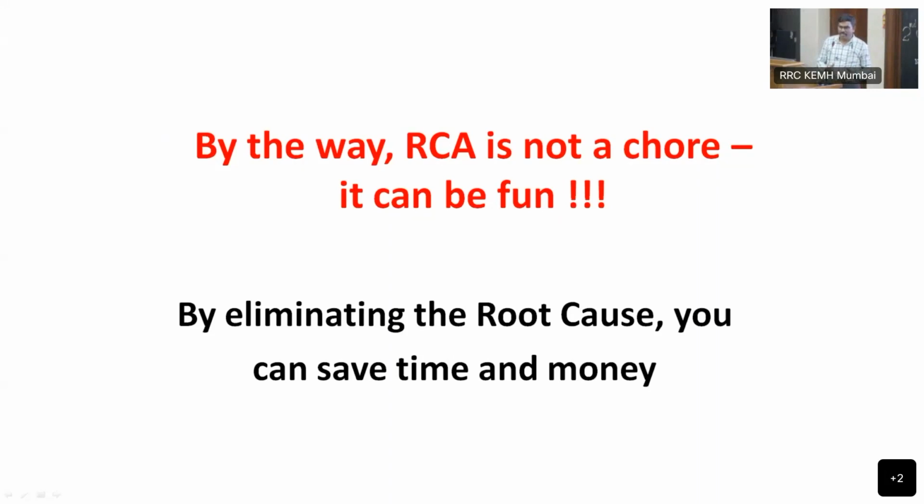Such sort of data, just like ma'am has given the trend of how your EQAS result trends each time. Probably you are switching from one system to another. That actually helps. It gives extra confidence to your stakeholders and makes your stakeholders feel happy.